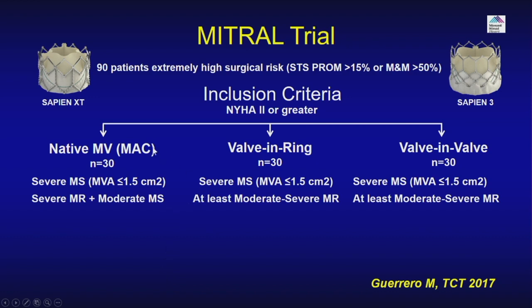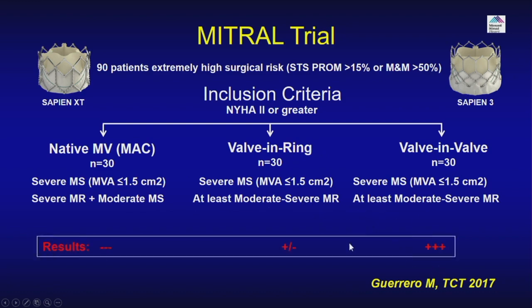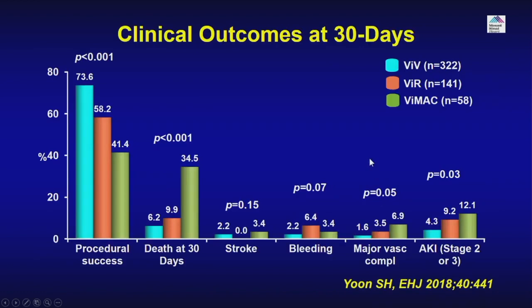Now, going on to that, there is a group of patients who could benefit not from the clip but, for whatever reason, from valve placement in the mitral area. But who are they? Patients who have mitral annular calcification, which is called native MAC. If they already have a valve in the mitral position, or they had a repair with a ring. So this was a trial that was presented in 2017, and subsequently you'll see the results of these patients.